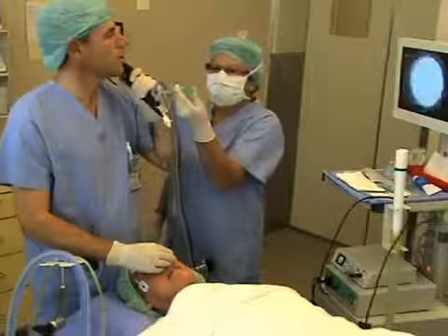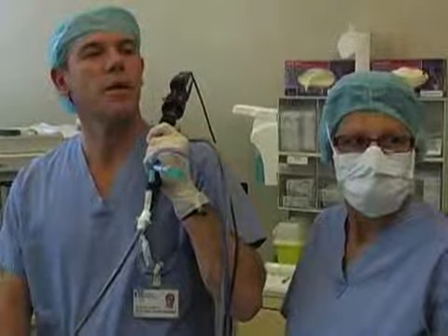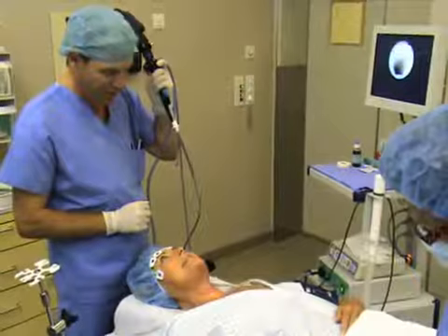Inject an additional 1 to 2 milliliters of local anesthetic through the channel of the fibroscope. This stimulus will induce a cough reflex and disperse the local anesthetic within the trachea. Make sure the fibroscope remains in the proximal part of the trachea, as only this area is anesthetized. The introduction of local anesthetic within the trachea and the supralaryngeal region will improve patient comfort and render the procedure easier.